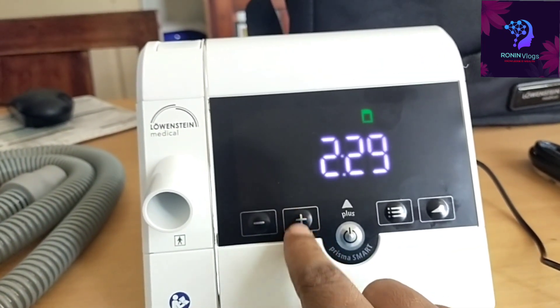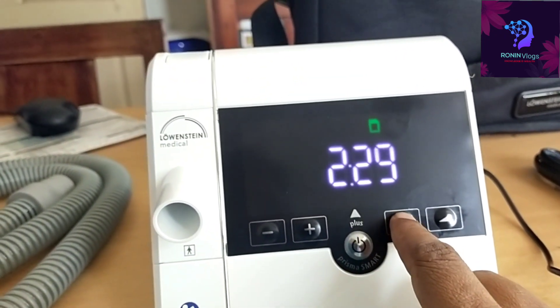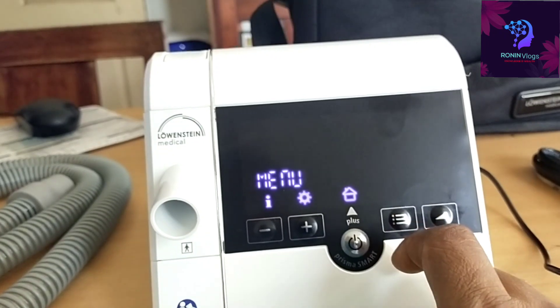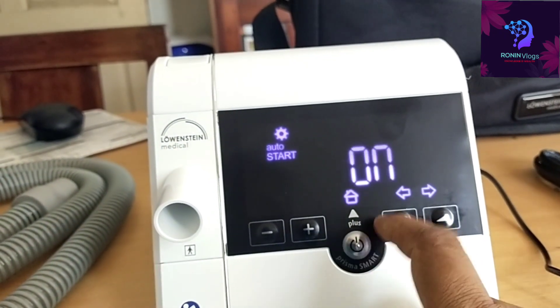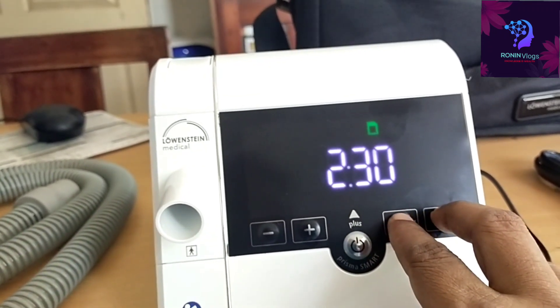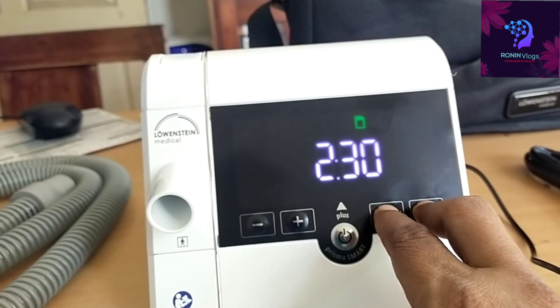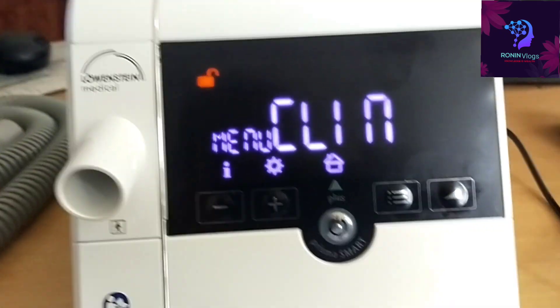Here is the minus button, the plus button, the on/off switch, and the menu button. In the menu settings, we can set auto start — if we connect the mask near to the patient, it will automatically start. To unlock the device, we need to simultaneously press the menu button and another button at the same time.